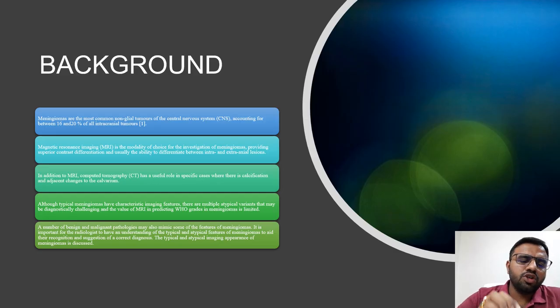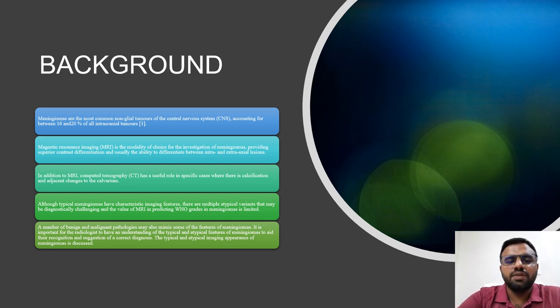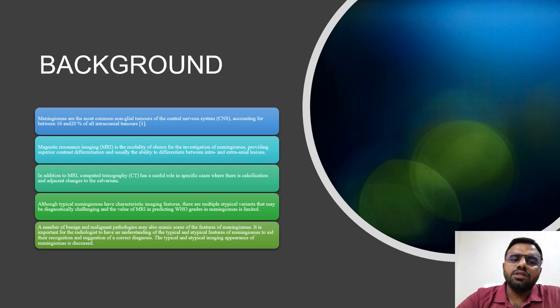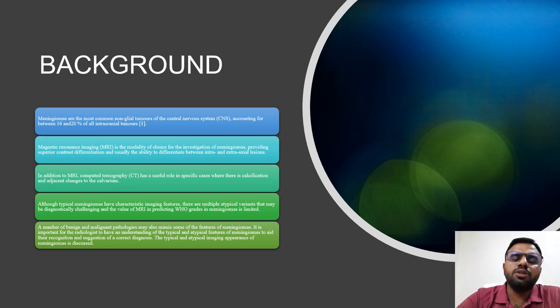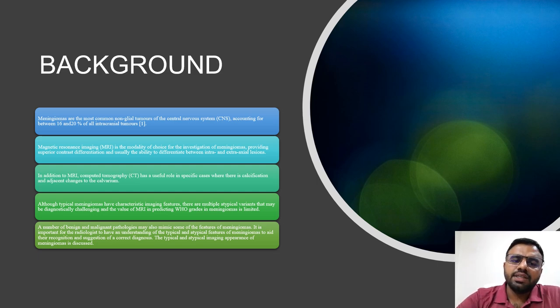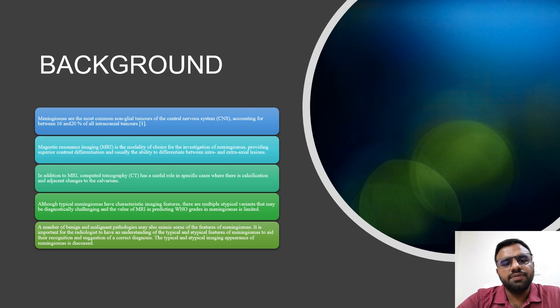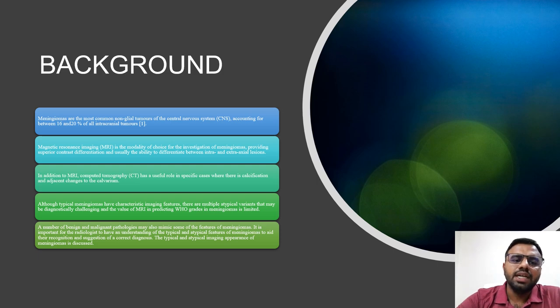Meningiomas are the most common non-glial tumours of the CNS, accounting for between 16-20% of intracranial tumours. MRI is the modality of choice for investigation, providing superior contrast differentiation and usually the ability to differentiate between intra- and extra-axial lesions. CT has a useful role in specific cases where there is calcification and adjacent changes to the calvarium. The value of MRI in predicting WHO grades in meningiomas is limited.